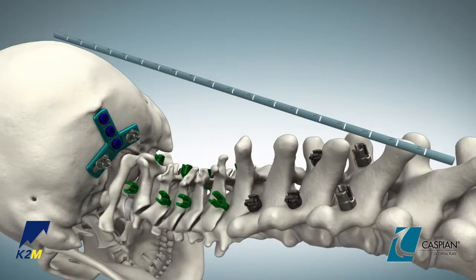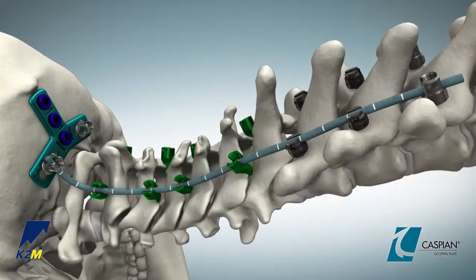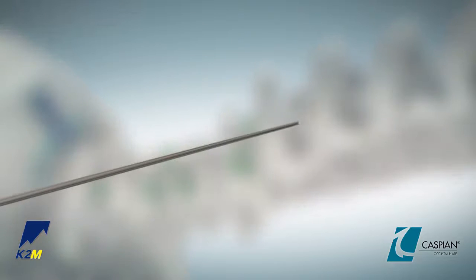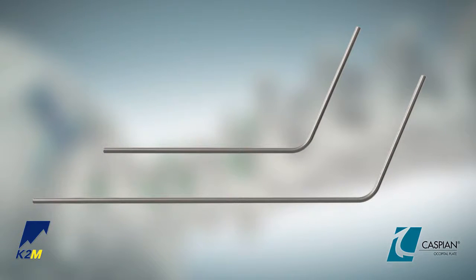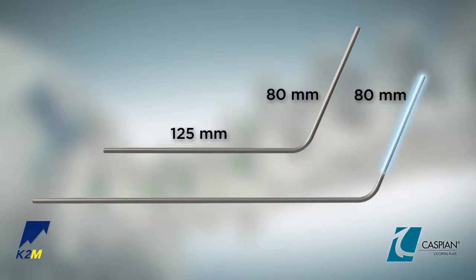Use a rod template to determine the proper length and shape of the rods that will fix the occipital plate to the hooks and Mesa Mini or Denali Mini screws. Both 300 millimeter cobalt chrome straight rods and titanium pre-bent rods are available. The titanium pre-bent rods come standard with a 115 degree bend in 80 to 125 millimeter and 80 to 215 millimeter lengths.